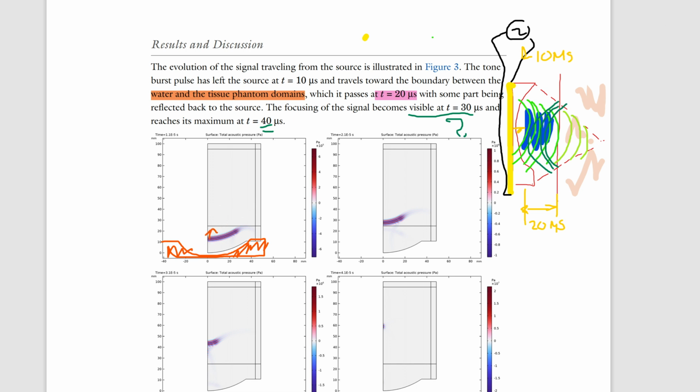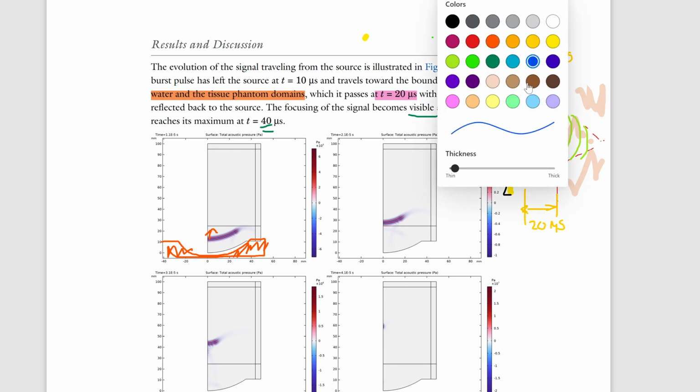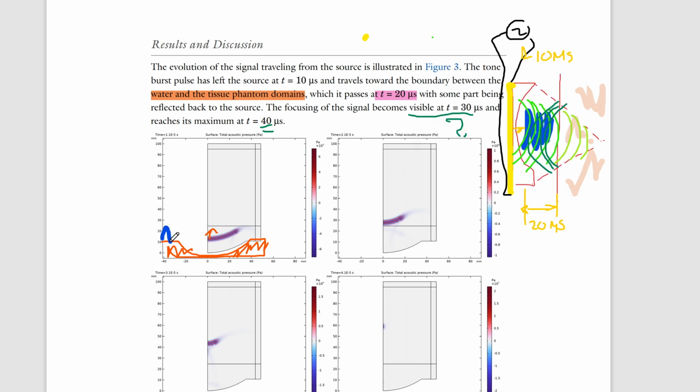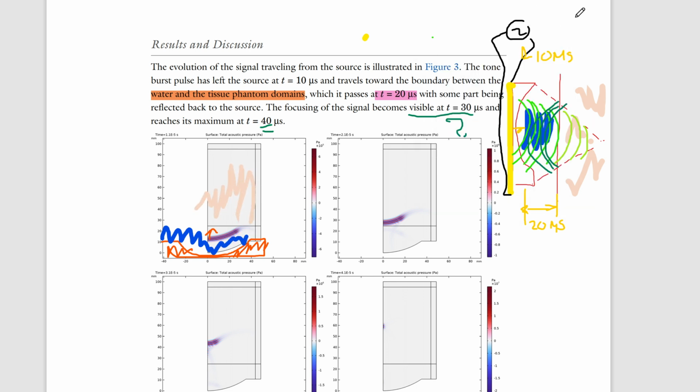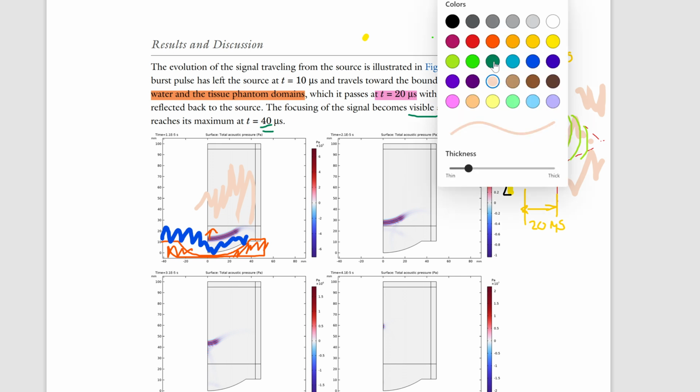We're in water right now. Let me draw blue. You can see this is water here. This is tissue here. Okay? So we're traveling upwards, towards the boundary. Time is equal to 20 microseconds. Okay, look at this. We have now passed the boundary.